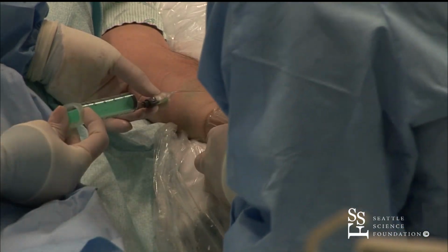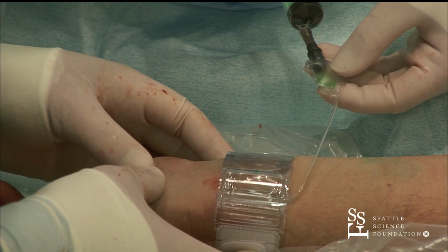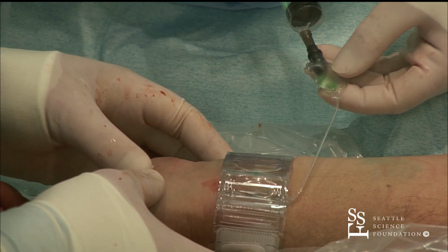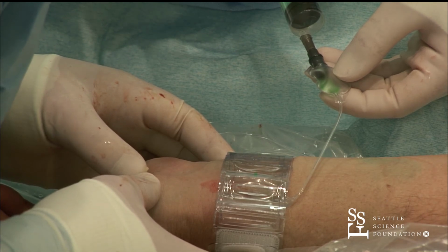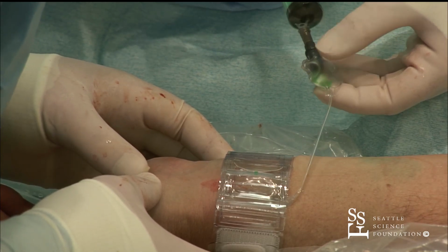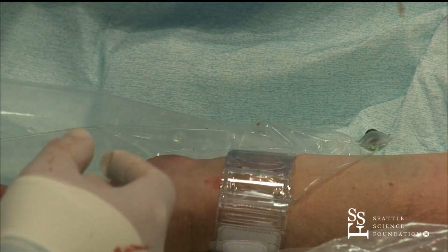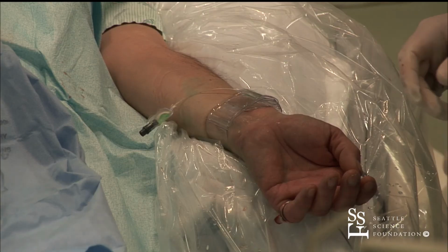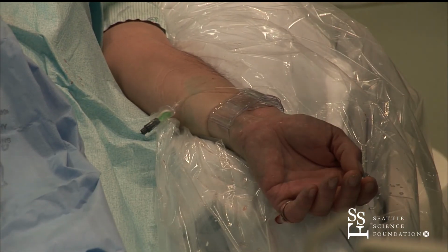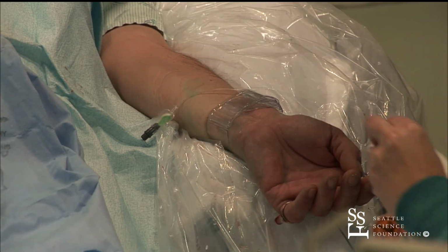And now the patent hemostasis, this is sort of the poor man's version of doing patent hemostasis. We're going to pull back on the air out of the TR band until we see bleeding. Keep going. There it is. Now you can see the pulsing going on there. So we're going to put 2 cc's back in. So 13 was about right. But typically you want to at least be at the point where you think you've just got control over the bleeding, so that ideally there's still flow down the artery, but you've got control over it. If you compress too hard, we've learned that that's sort of a bad thing.